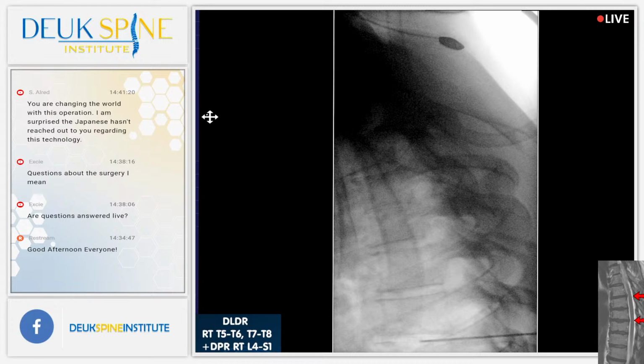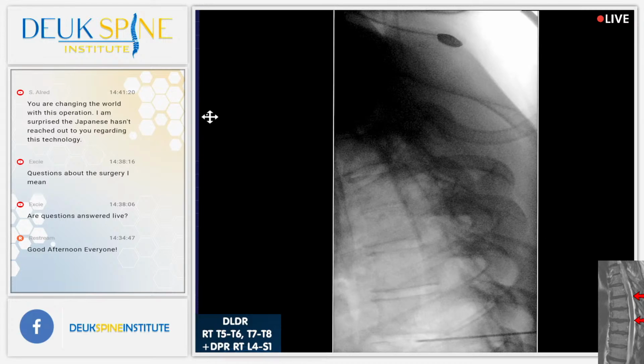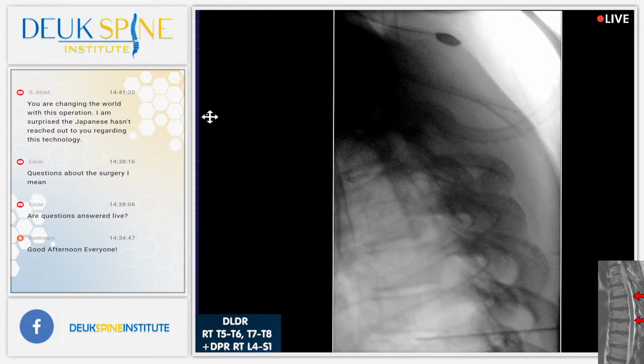So we need to line everything up so that all the angles are proper in order to do that. And that's what we've spent our time doing, lining up the X-ray so that we have reliable navigational data from the spine itself and through the machine.